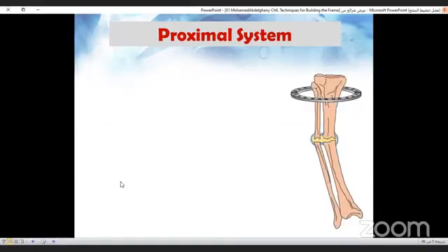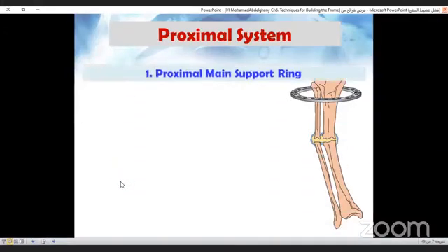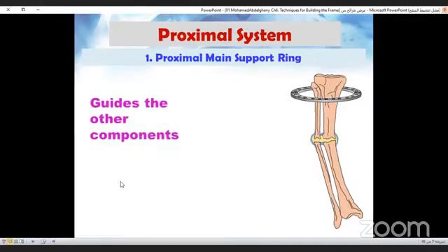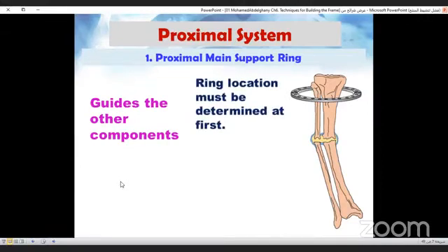The first ring is the proximal main support ring or the guide ring. It guides the other components, so its location must be determined at first using the C-arm.